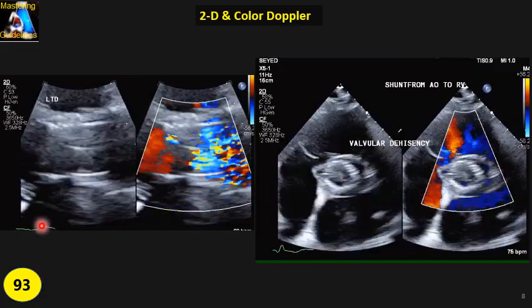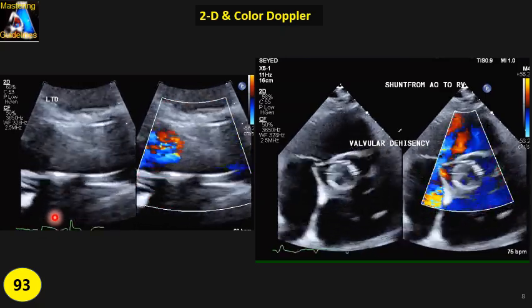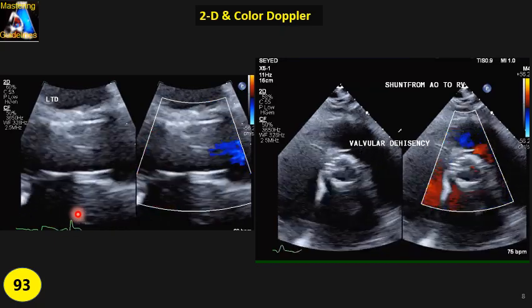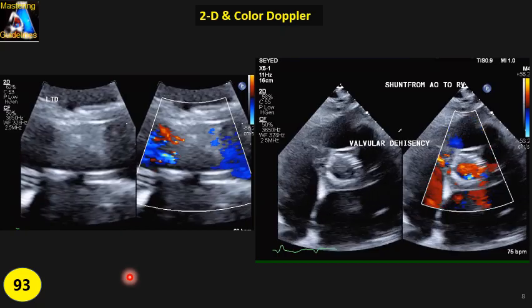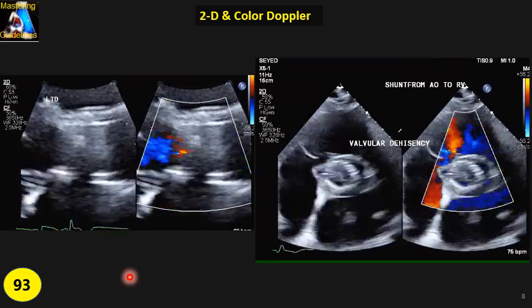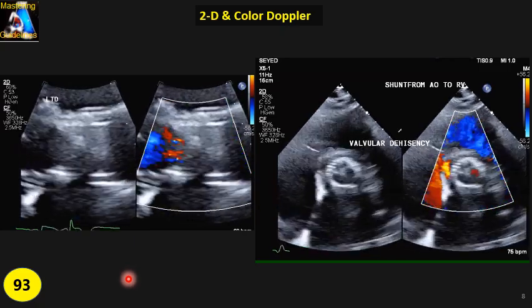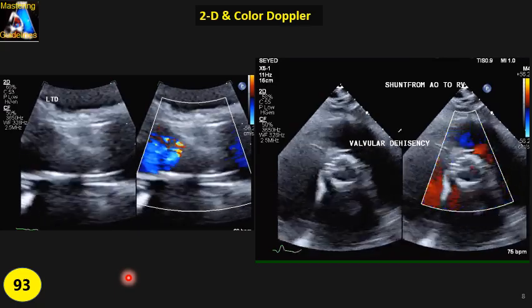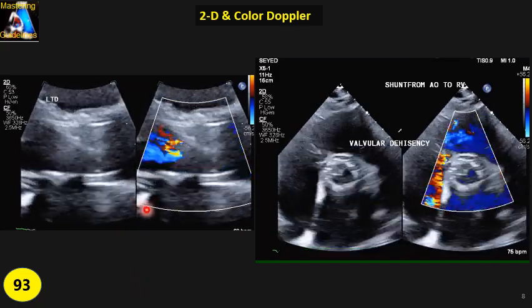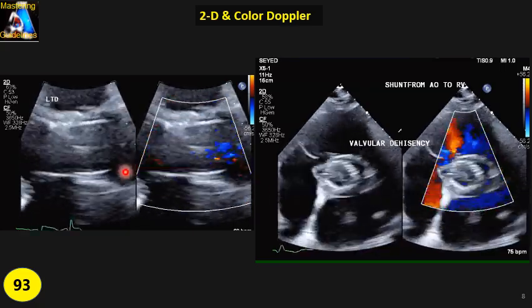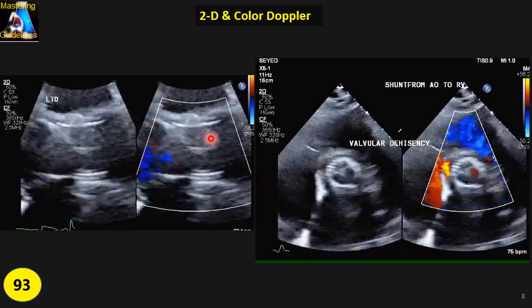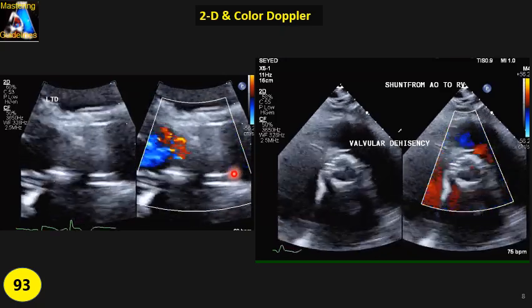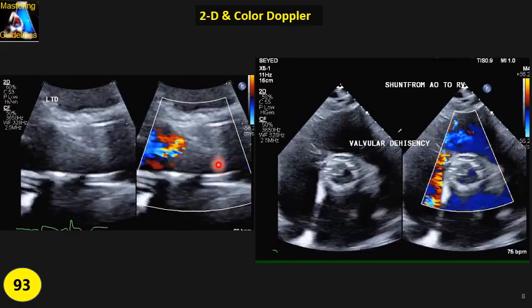Now let's see how we evaluate TAVR. We evaluate it in four views: first PLAX, then PSAX, then apical five, and apical three. Sometimes you have to go to subcostal as well, depending on your primary findings. On the PLAX view, when you have a good image, zoom in on the valve. The region of interest should be a little bigger than just the valve — show a little more of the LVOT, a bit of the mitral valve, and the ascending aorta.